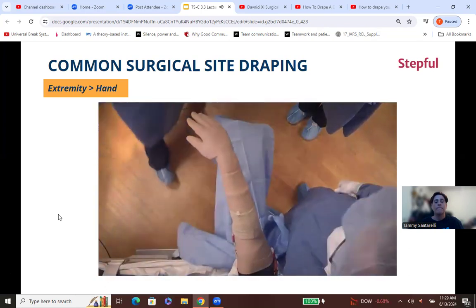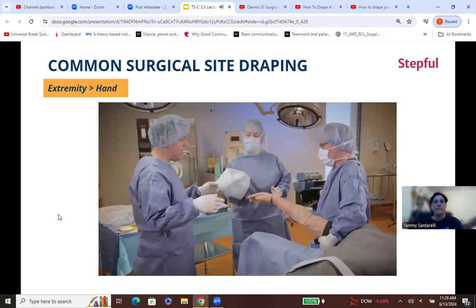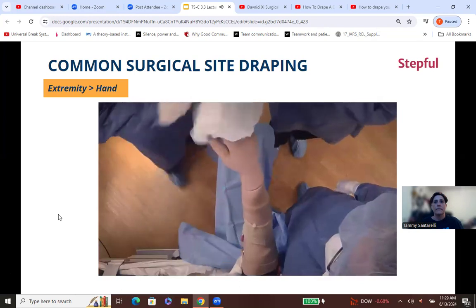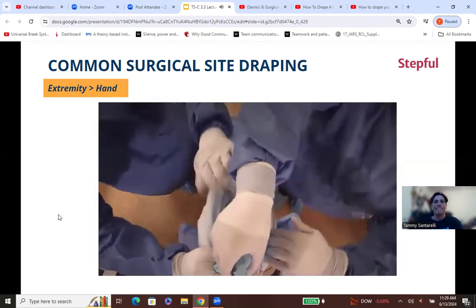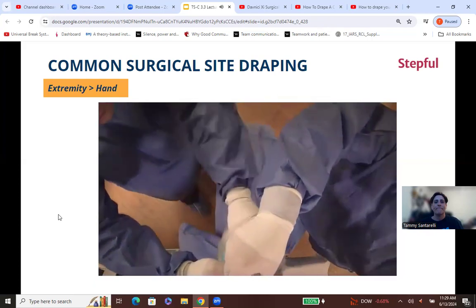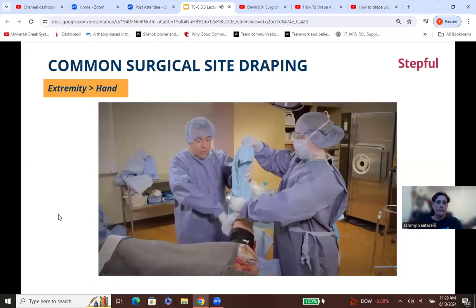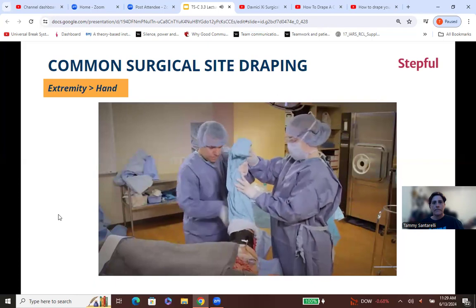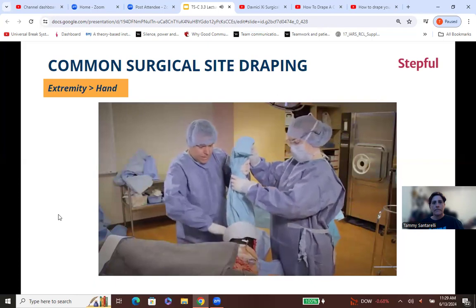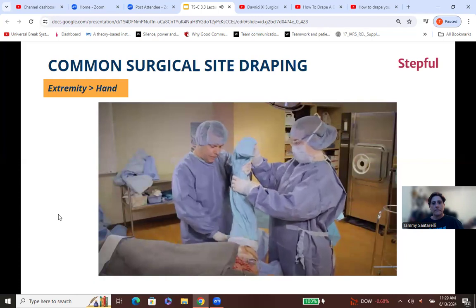The next step is to give the surgeon the stockinette. They're going to grab the hand so that the circulator can get out of the picture. Got it. And we're going to completely unroll the stockinette to over the tourniquet, making sure that we stay on top and under the cuff of the tourniquet. Of course, I like to try and get it completely over the tourniquet just to get that completely covered and out of the way.